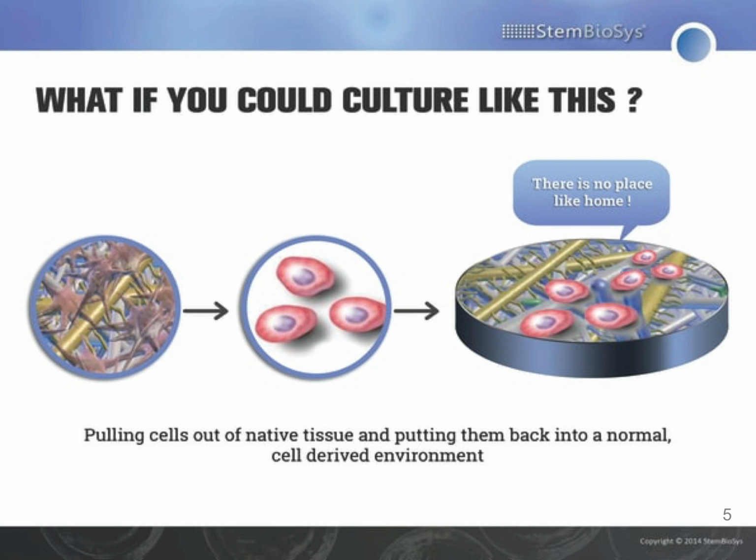So what we're trying to do here is change that scenario in that you can isolate cells from their extracellular matrix and their normal environment and put them into an extracellular matrix that was produced and built by cells. So this is not an extracellular matrix that's been extracted or a protein that's been extracted, purified, and coated onto a dish. This extracellular matrix is actually built by cells onto the surface. And that's what we're using to put cells back onto when we do this cell culture method.